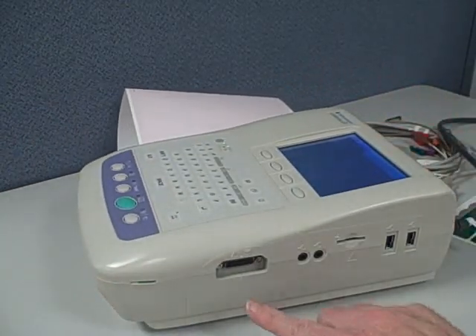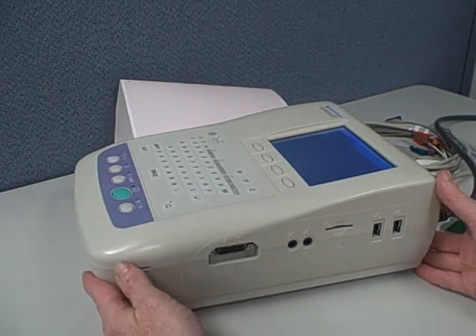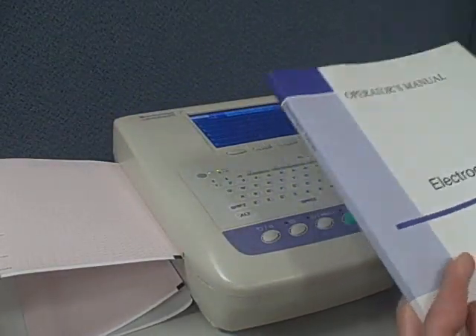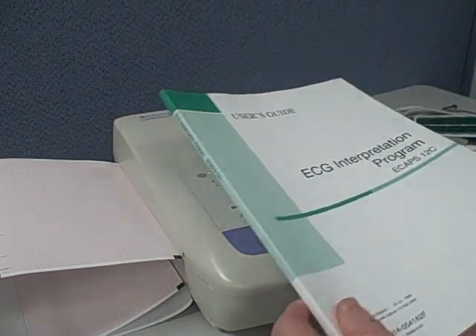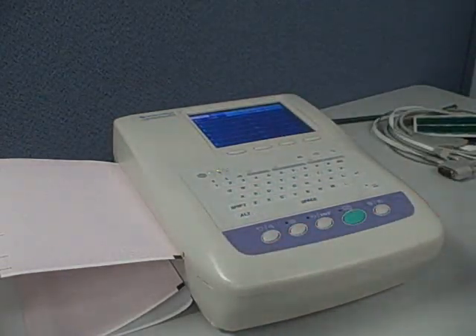Here's a look at the side of the machine where the patient cable is attached. There's an SD memory card slot, which is a nice feature for outside storage. Also a rechargeable battery. Three manuals come with this unit: an operator's manual, an interpretation manual, and also a service manual.